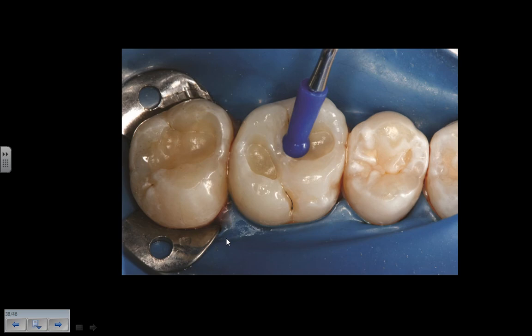I'm adapting the composite within the cavity preparation. In this case, I'm using a silicone-tipped instrument. The composite doesn't stick to the silicone tip. You can use your burnisher in your restorative cassette. I'd wet the burnisher with a little bit of adhesive. In fact, you can shape the composite with your PFI instruments to form the anatomy that you want, similar to as if you were waxing.